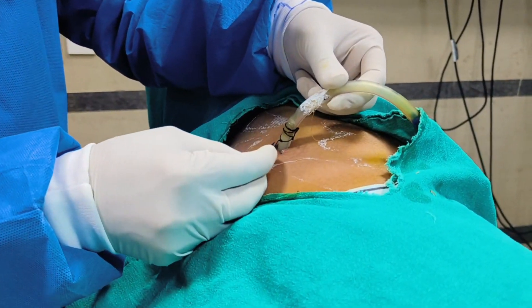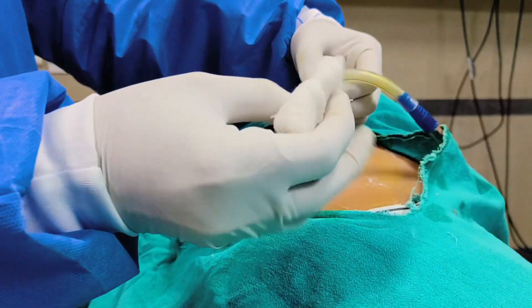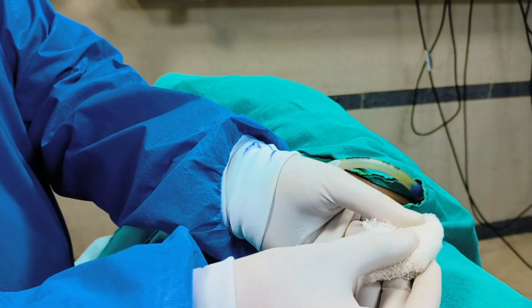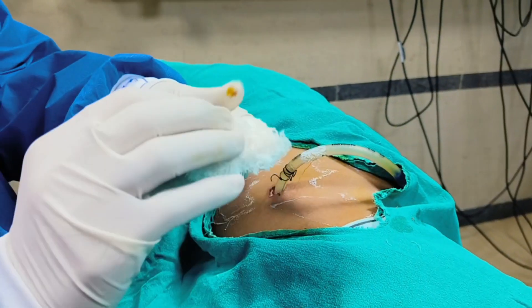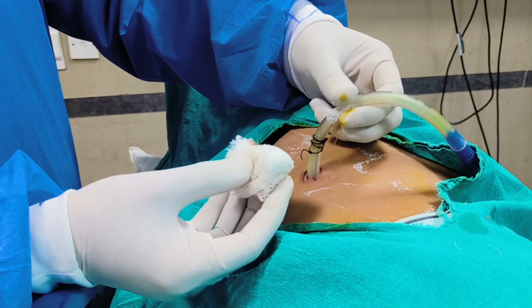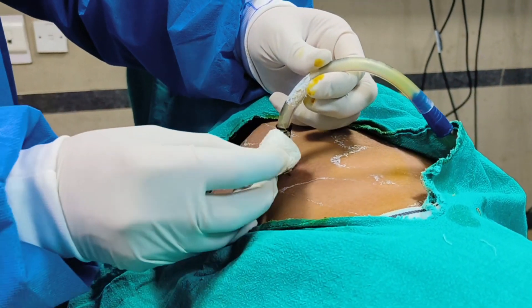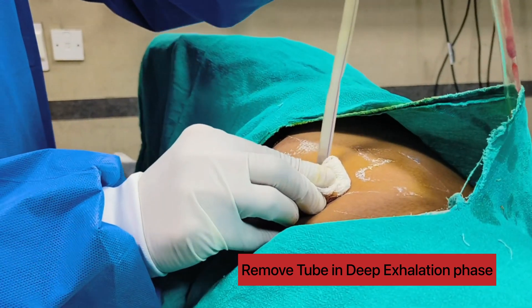Now we will take one gauze piece and apply a little betadine. We will compress the ICD site so air should not go inside. Ask the patient for deep exhalation, and while exhaling, remove the chest tube.